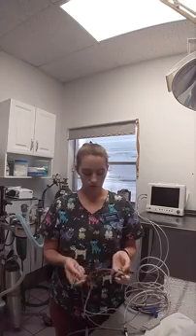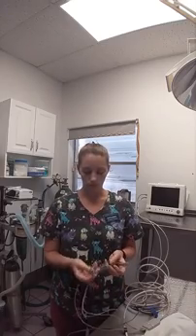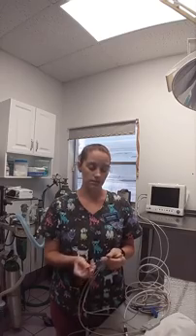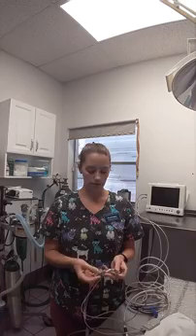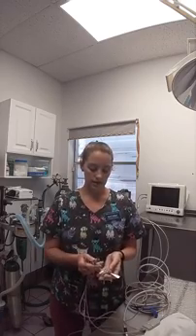So we have 3 clips, and we have white, which is right, so it goes on the right front arm or front foreleg. The black is the left front leg, and then the red is the left rear leg.